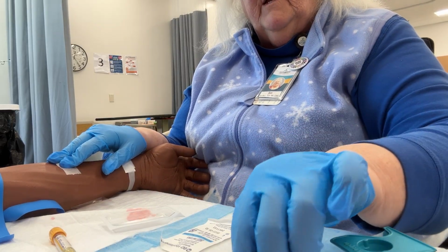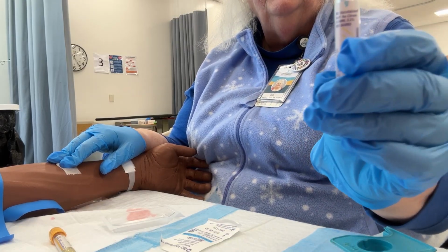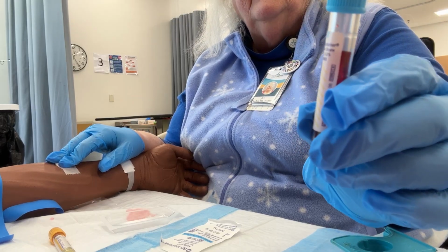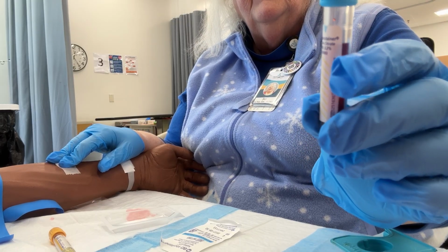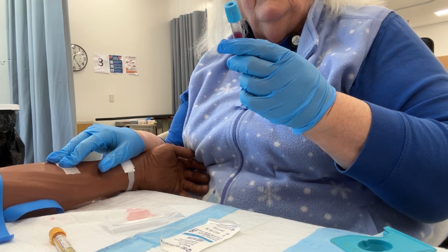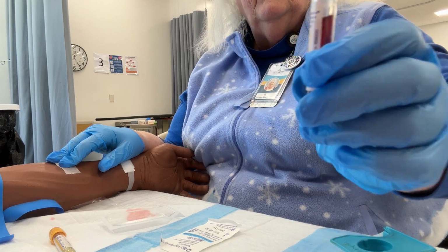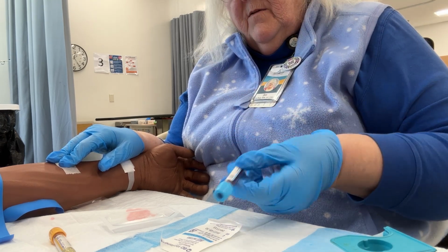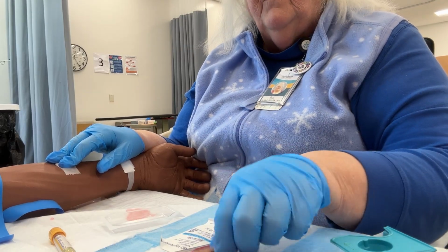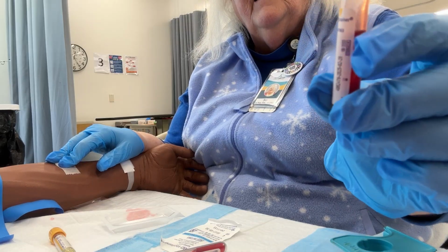You also want to make sure that your tubes are full, particularly a blue top tube. A blue top tube has these yellow lines. It needs to be to the top of the writing, okay, right to there. Not where it says BD, but where it says sterile R, right there. Okay, if it's not, it's considered a short tube and they'll return it to you. Something like a gold top tube, same thing. The full line is right there.